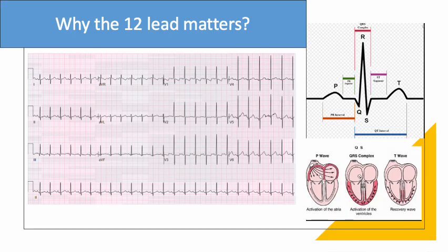But just as a review, when we think about each part of the electrocardiogram, we think about the P wave as atrial depolarization. We think about the PR interval as conduction through the AV node. We think about the QRS as ventricular depolarization, and we think about the T wave as ventricular repolarization. And as an electrophysiologist, we assess each part of the electrocardiogram, each morphology, to help us understand what somebody's baseline looks like, and then use that baseline to compare it to any active tachycardias or bradycardias and assess what we think the rhythm is.